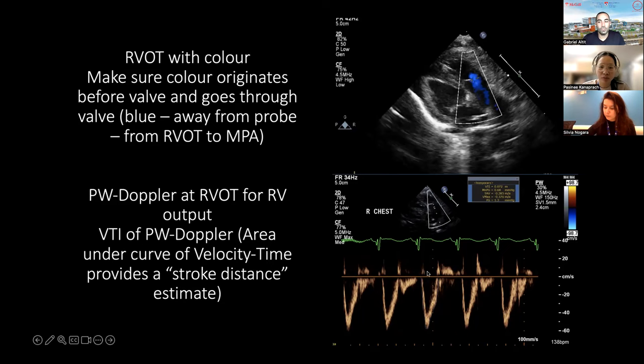This is a representation of a pulse wave Doppler, PW. Pulse wave Doppler tells you you get velocity estimation at exactly where you're sampling your velocities. So my line of interrogation is here. I'm sampling here. This is going to give me time, where you see QRS here. So the time axis is here. And this is going to give me the velocities. So you see centimeters per second.